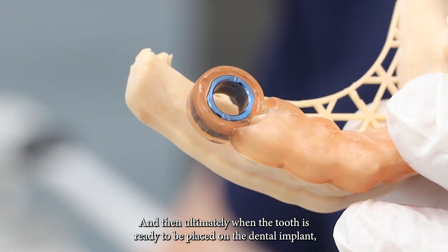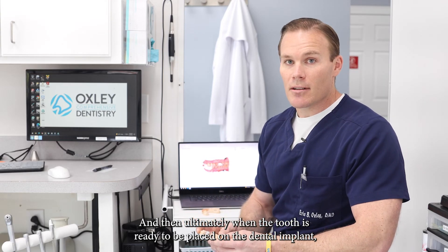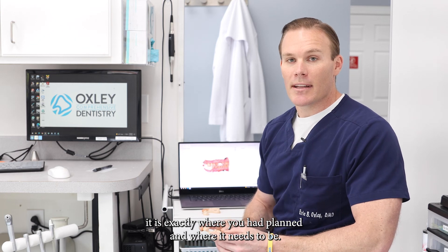And then ultimately when the tooth is ready to be placed on the dental implant, it is exactly where you had planned and where it needs to be. That's this episode of Oral Bites.